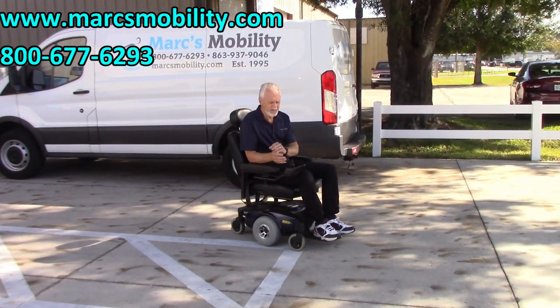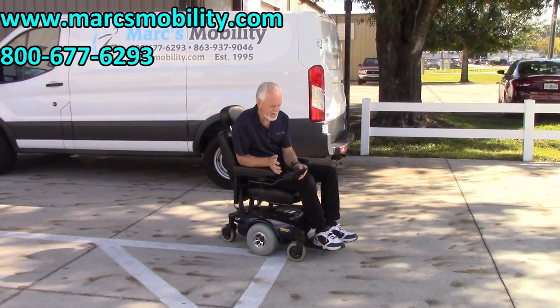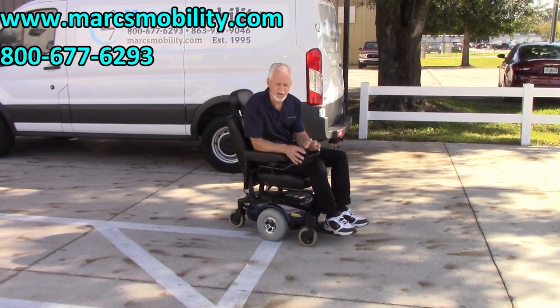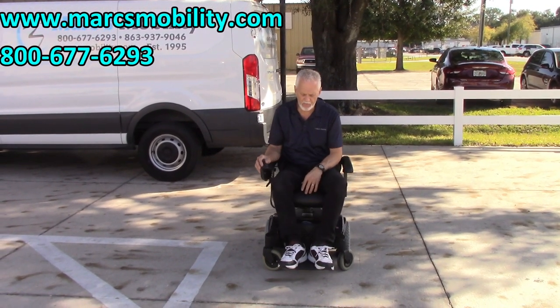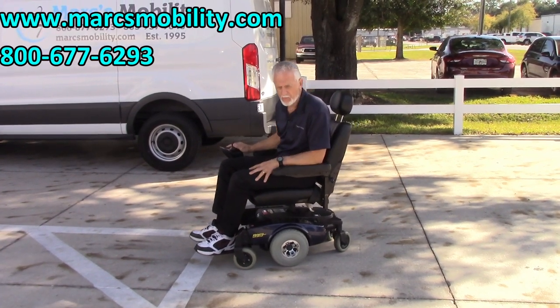This power chair is very easy to drive. So if you need a power chair that's really easy — not too sensitive — this would be the slow speed right here. This is speed number one; I don't think you can get in trouble with that speed. You've got five speeds. Very easy to learn, very nice power chair. Solid tires, ready to go.